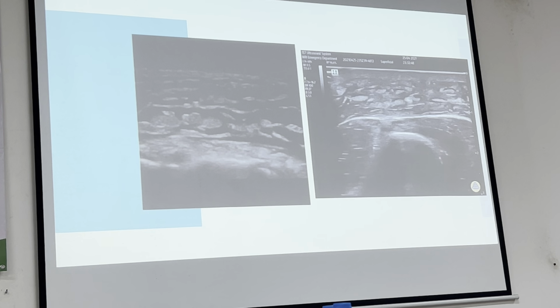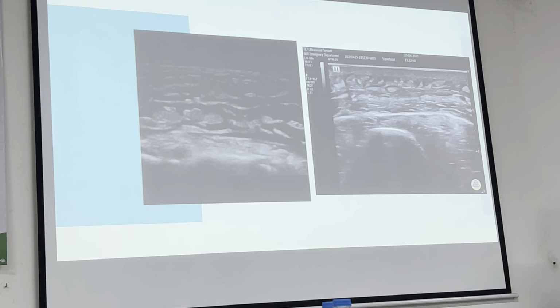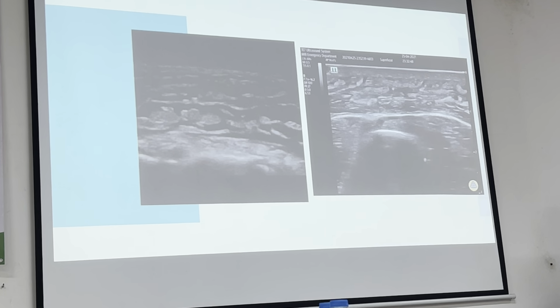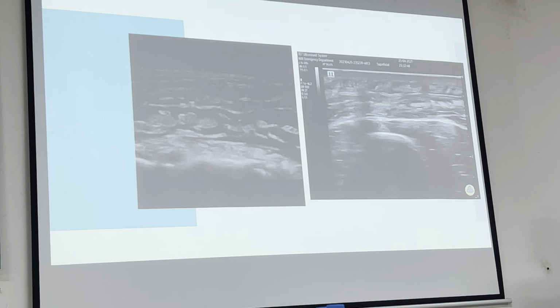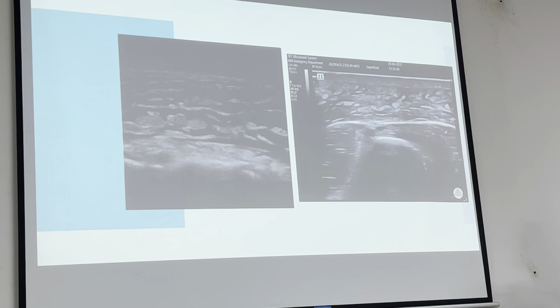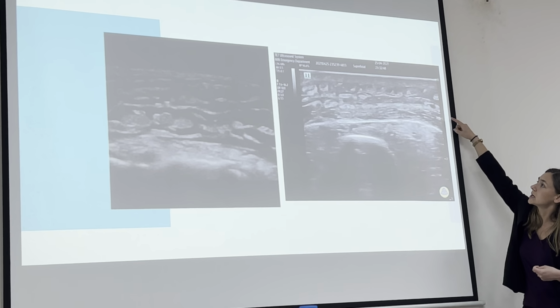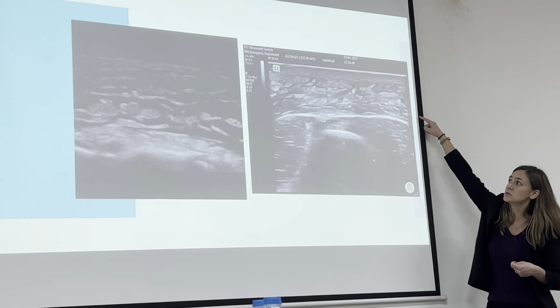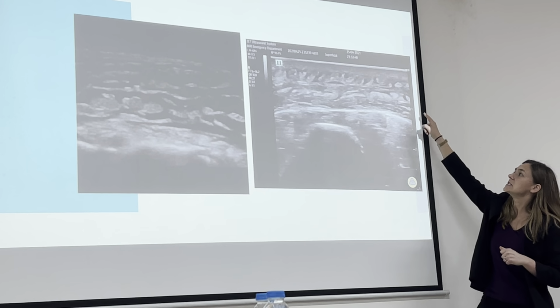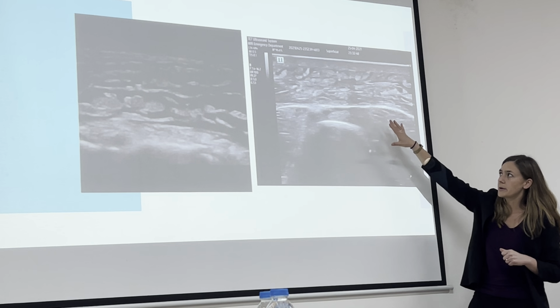Where we can start to see, as known as cellulitis, that you're getting that localized inflammation, which causes a chain reaction with your cytokines to create some leaky vessels, and you get some extravasation into the local tissue, which causes the fluid buildup. You're seeing that mostly in the subcutaneous fat area. This is something that we call cobblestoning, because it looks like all of those stones next to each other, and you start seeing the individual fat lobules, which shows us that there is surrounding edema.